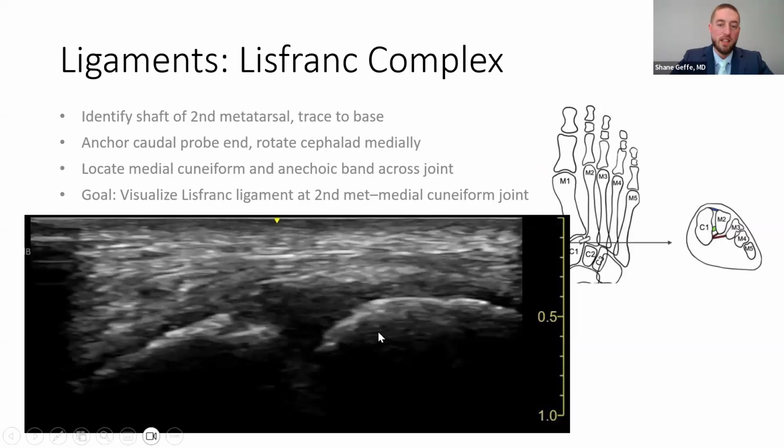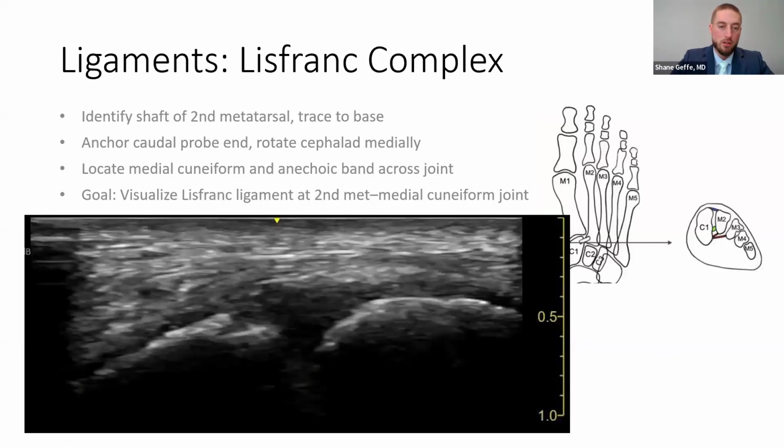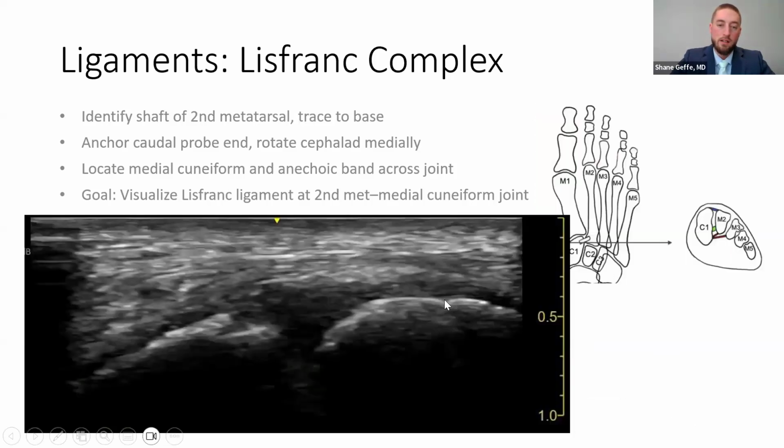And then this is the case. I had to use a different ultrasound for this case, but again, a very similar picture to the quote unquote normal I just showed you. Here on this side is the base of the second metatarsal. I do have my probe oriented more or less in this plane. And here would be the medial cuneiform.